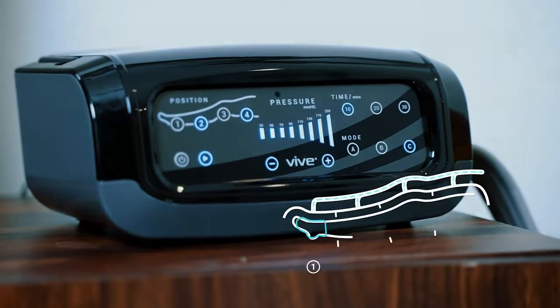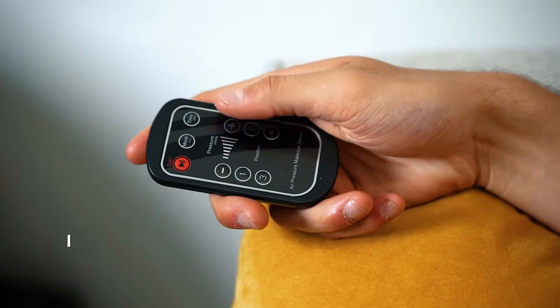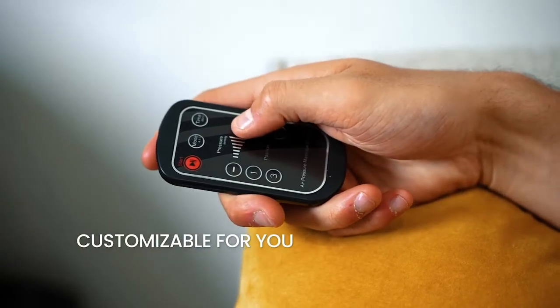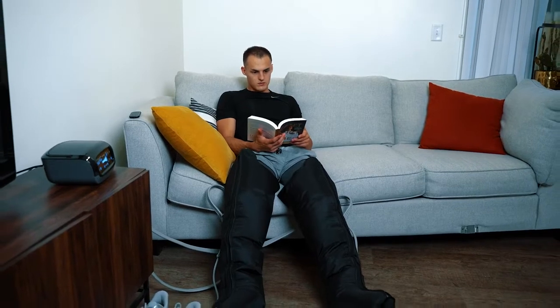Get full coverage with four air chambers for optimal compression. And with multiple modes, varying intensities and time durations, you can customize your own sessions from home to be just what you need. That's right, just for you.